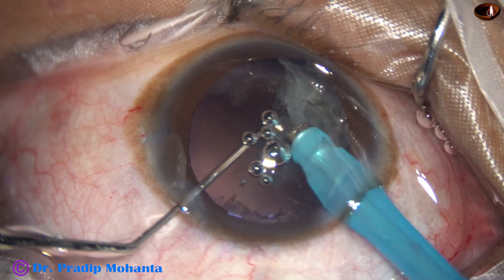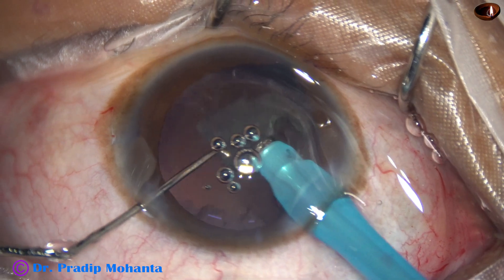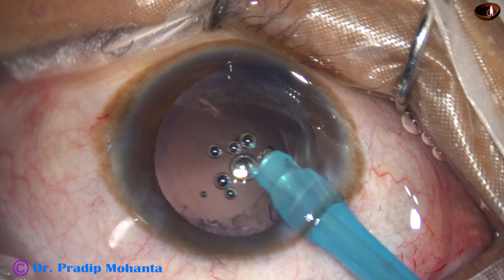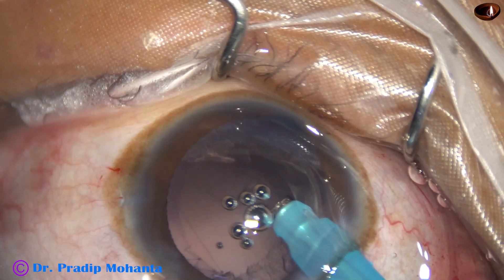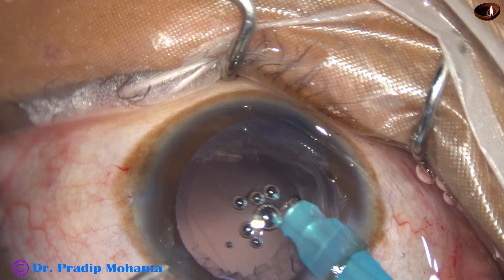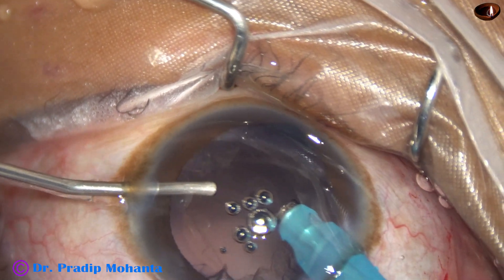Here I can see that there is a big rent. Still, the posterior capsule is intact — the anterior hyaloid membrane is intact, and I have managed the nucleus.